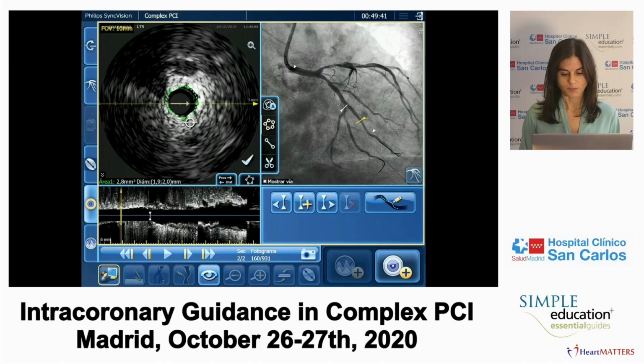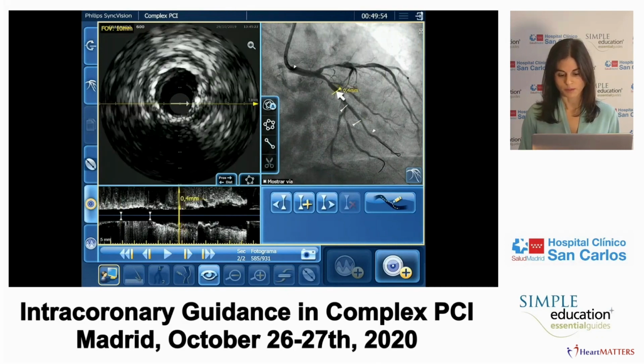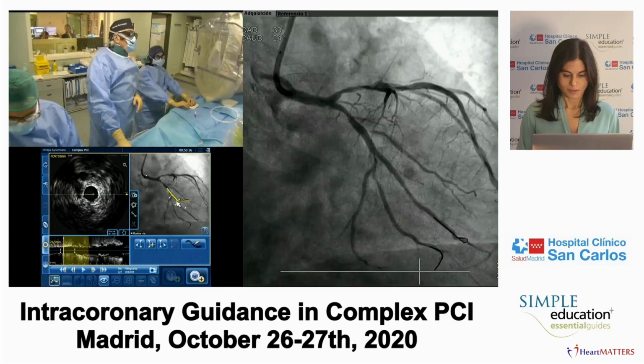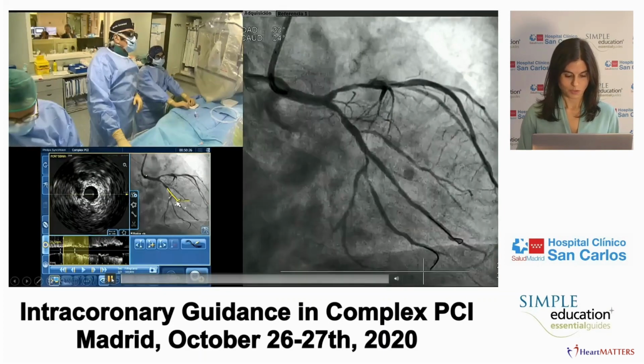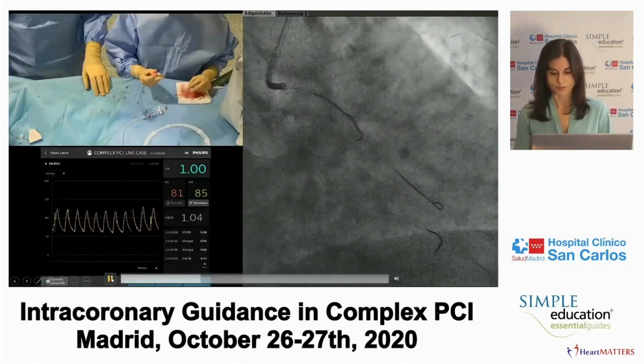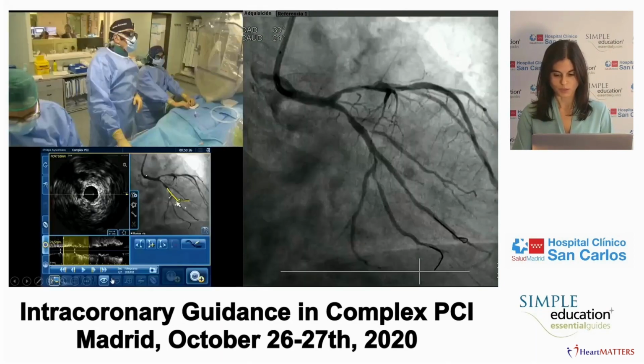Obviously a very relevant question at a point where we are seeing great interest in the use of physiology to assess the results of PCI, in a way making the point that the uncertainty you have when analyzing an angiogram before PCI also applies immediately to the images that you obtain after PCI. So, Ashok, what would be your comment at this particular point? And then I'm very curious to know what Richard thinks.